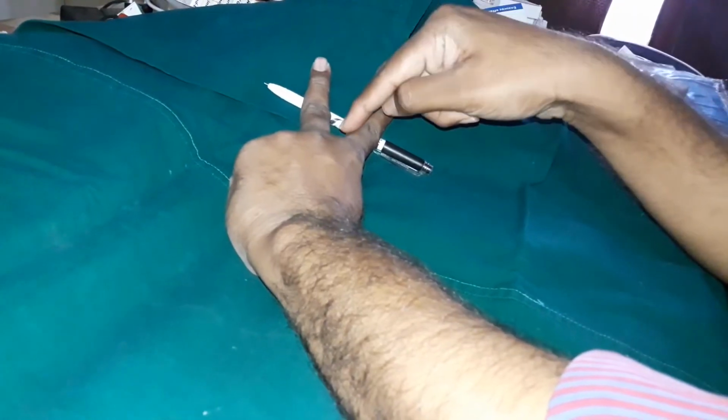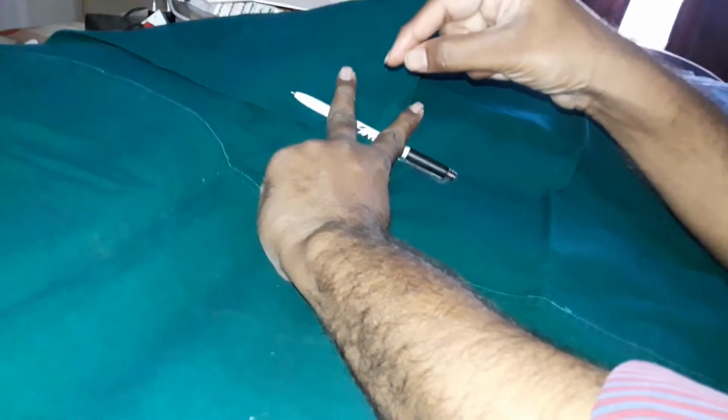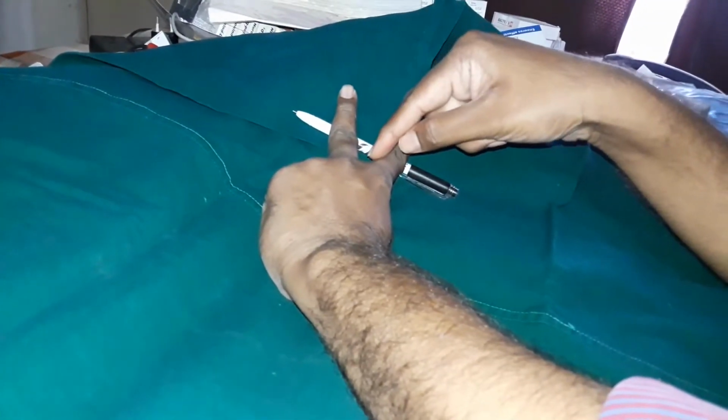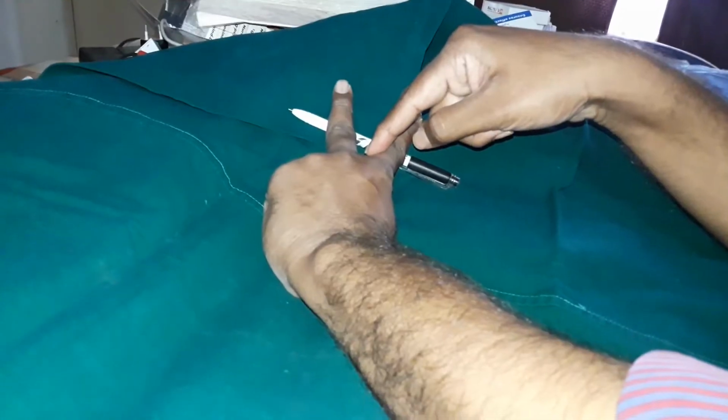So be cautious. Whenever you get a small spurt of bleeding, or when you identify the epineurium, you can stop there.